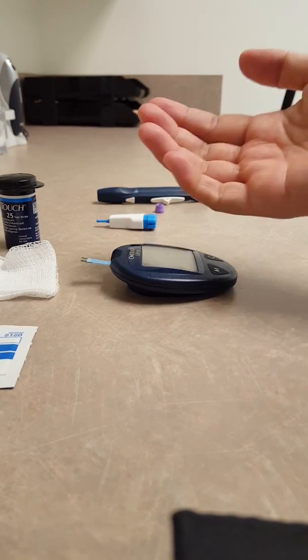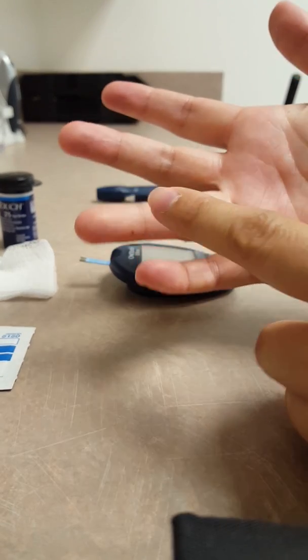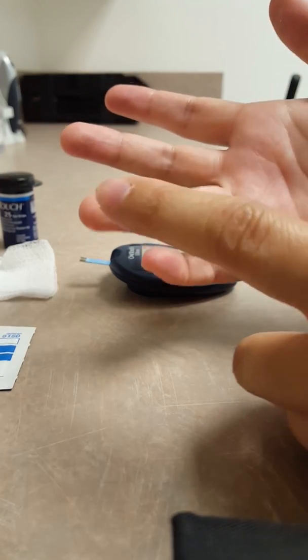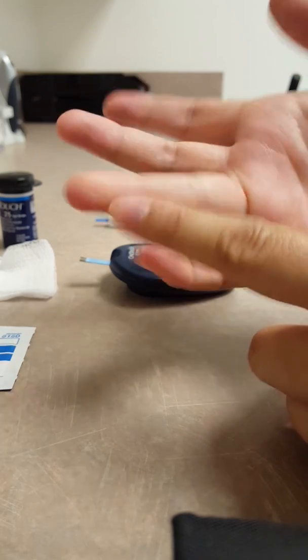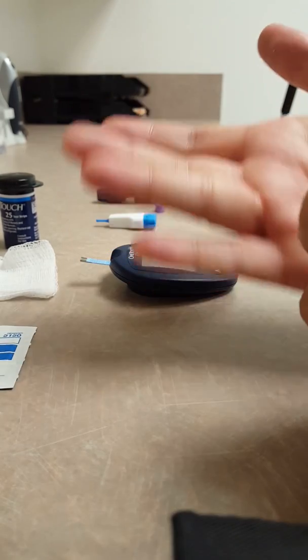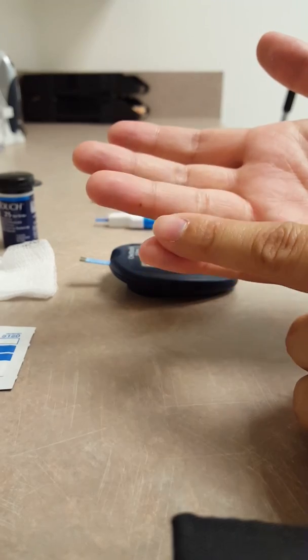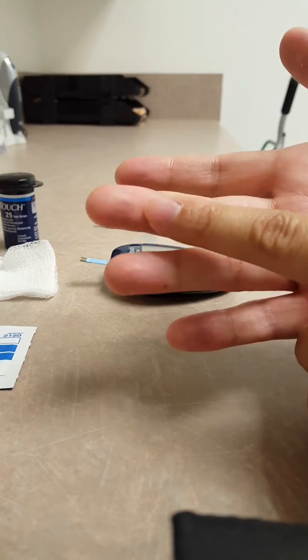So the finger that's best to use is normally your ring finger. You might hear people say that you shouldn't prick the middle of your finger — it should be on the side. But it just depends on you or your patient; they'll let you know which finger they want to use. You should alternate between fingers and not keep poking the same exact fingers, so usually they'll go between the ring finger and middle finger.